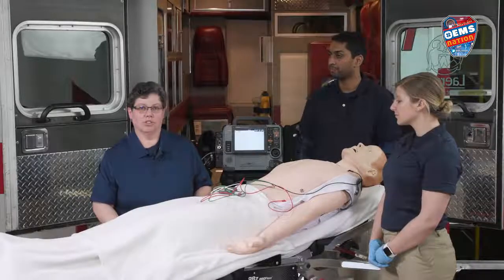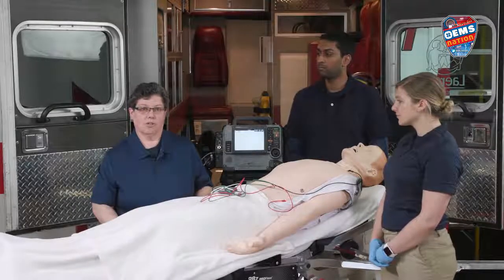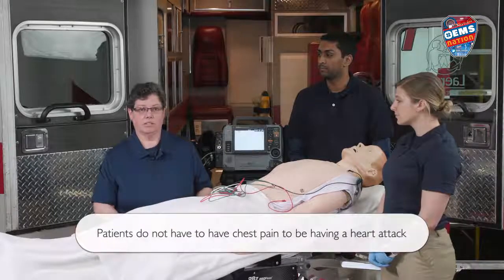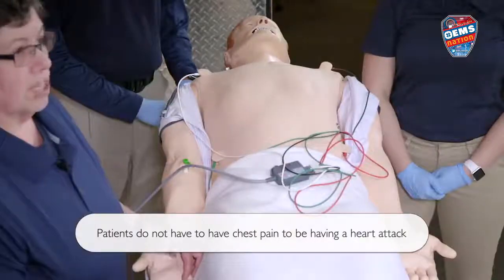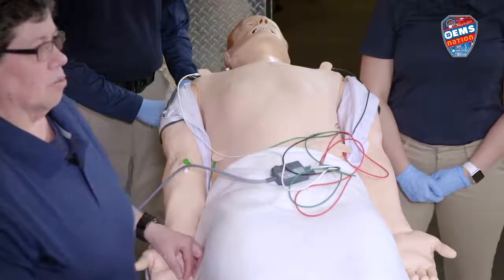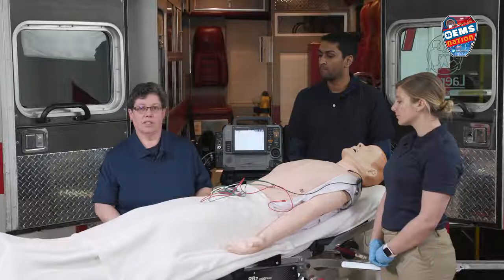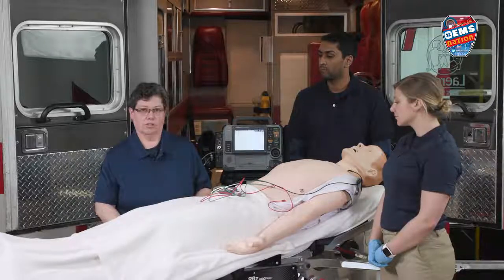12-lead EKG acquisition is a new skill for BLS providers. We want to do this skill on patients that are presenting with chest pain, dizziness, shortness of breath, weakness, nausea, or vomiting. We're going to acquire a 12-lead EKG and show you how to do that, and then you are to send it to the hospital so the doctor can interpret it.